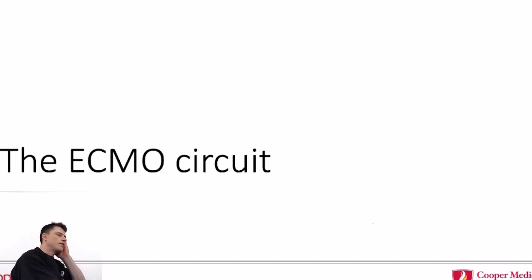Yeah. So BMI, I think, poses some challenges with cannulation, and then maybe some considerations in terms of how their recovery goes with rehab and things. But when we've looked at the literature, and Emily, maybe you want to chime in, it's been a traditional relative contraindication, but in terms of the outcomes, I believe the literature we looked at was similar. It's interesting because in that scenario, sometimes the large abdomen and heavy chest wall contribute to higher airway pressures, and that's not actually a lung problem. That's a habitus problem. So in some cases, that might be sort of protective for their lungs.